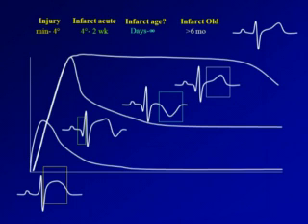After 6 months, smaller infarcts may see their T wave normalize. So I see a Q wave and a positive T wave. I'm going to call it infarct old. And lastly, 30% of inferior infarcts that tend to be smaller, beyond 3 years, can actually lose the Q. The fibrotic segment can essentially retract so that we activate around it and our Q wave melts away. You know what we're going to call that? Normal. If you don't have an old EKG, without a Q wave, you can't make the diagnosis of myocardial infarction.